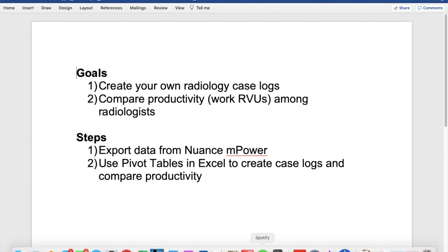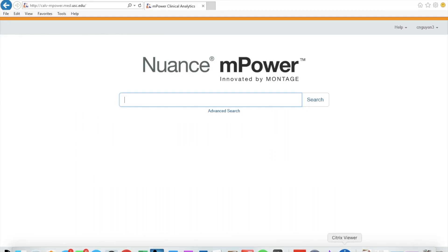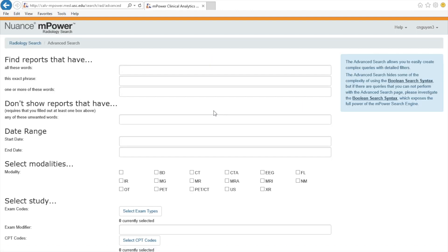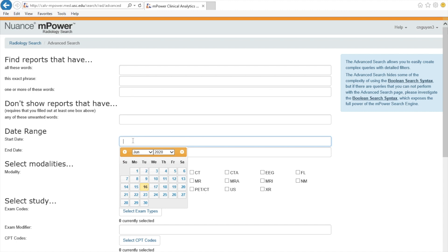So let's get started. The first thing you want to do is log into Nuance mPower. Here's the link up above, and you usually have to do this through a VPN or on a computer at Keck. So you click Advanced Search.